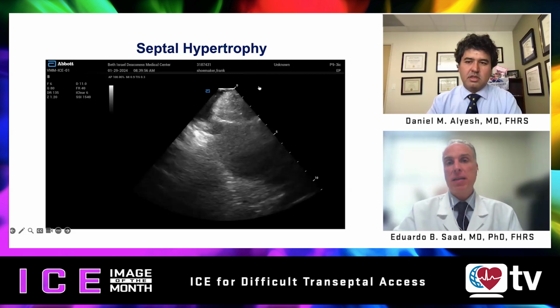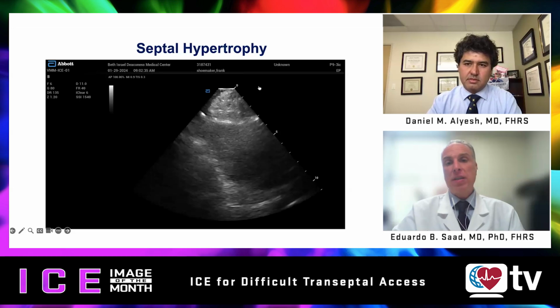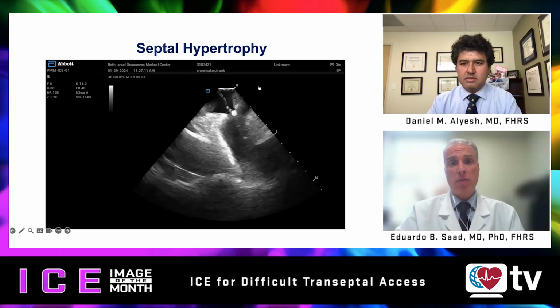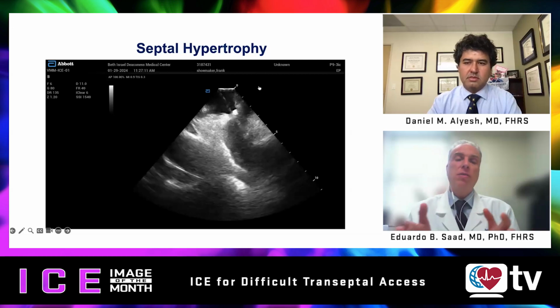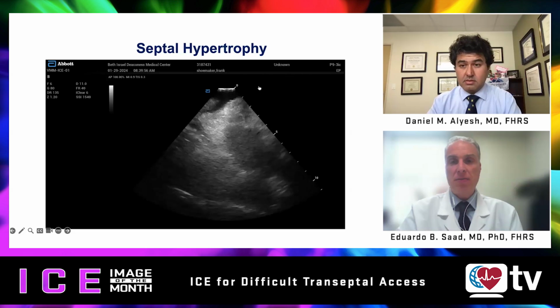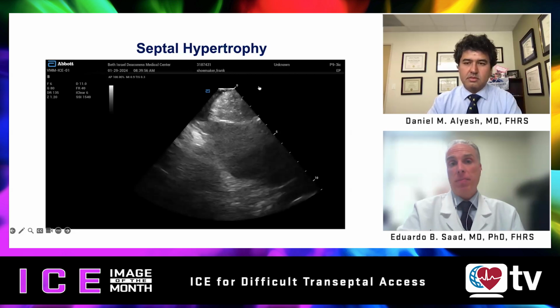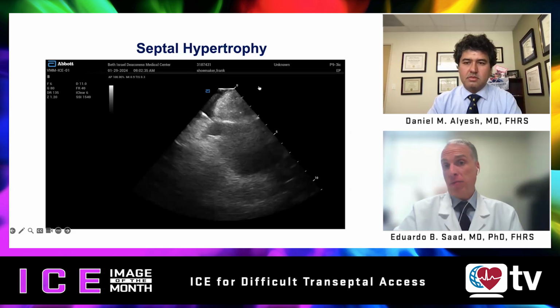I truly believe that with ICE, we have fewer complications and more precision. Especially in the Latin American environment, cost containment is really a very important part of our job. I think that having it available at the lowest possible cost, if it's safely being re-sterilized with protocols that you can keep track of, can actually make it available more widespread than we thought before.